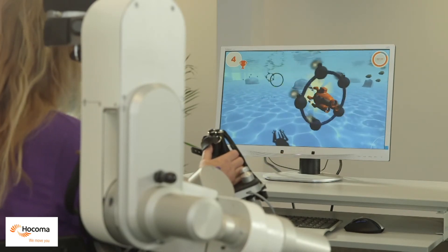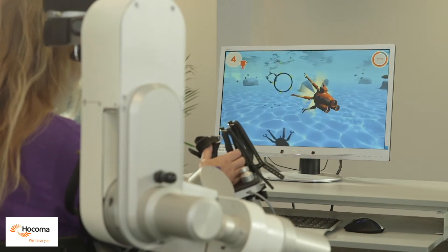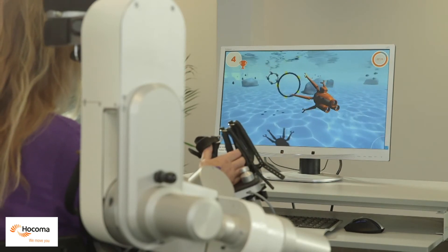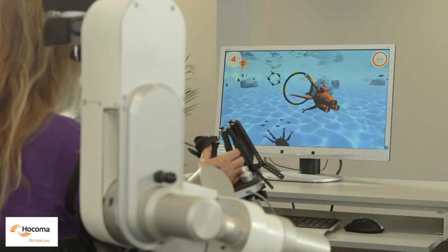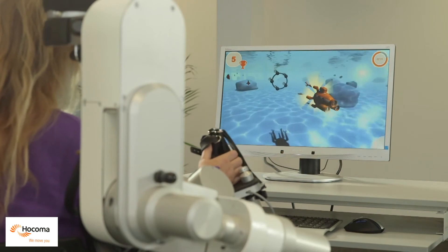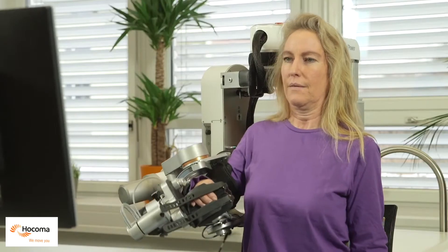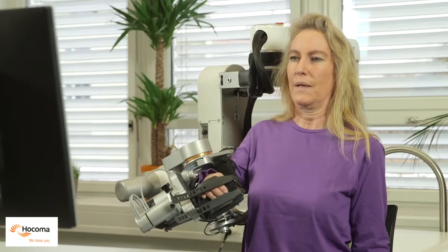The remaining degrees of freedom include supination and pronation of the forearm, flexion/extension of the wrist, and closing and opening of the hand.